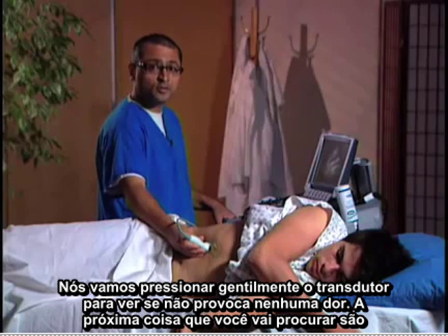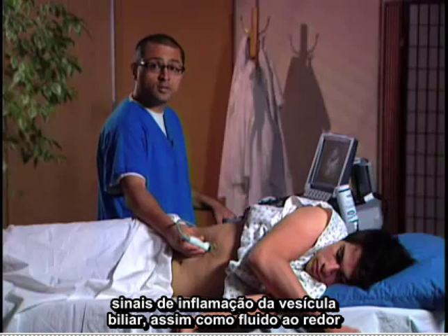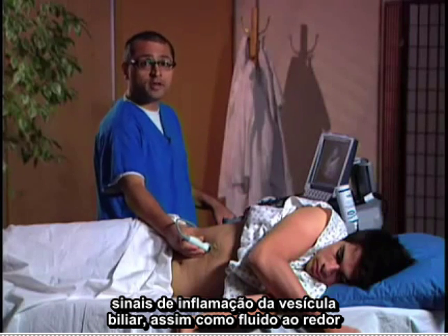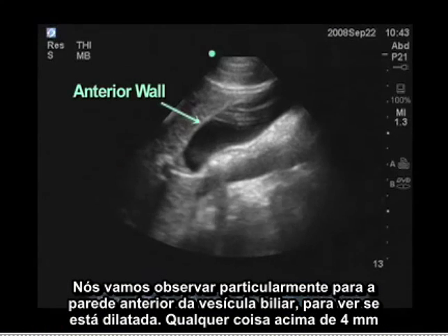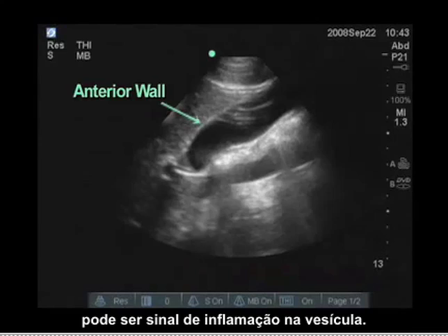The next things you're going to look for are signs of inflammation of the gallbladder, such as fluid around the gallbladder, that being pericholecystic fluid, and also gallbladder wall thickening. We're going to look particularly at the anterior wall of the gallbladder and see if this is enlarged. Anything above 4 millimeters or so would be a sign of gallbladder inflammation.